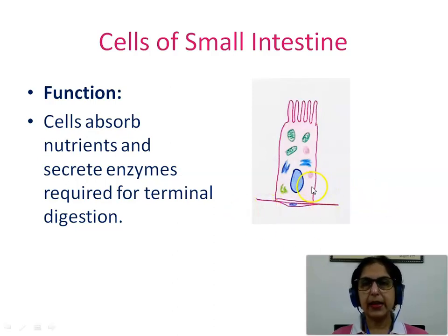This here is a diagram showing a single enterocyte, tall columnar cell with an oval basal nucleus and the luminal surface showing regularly arranged microvilli.